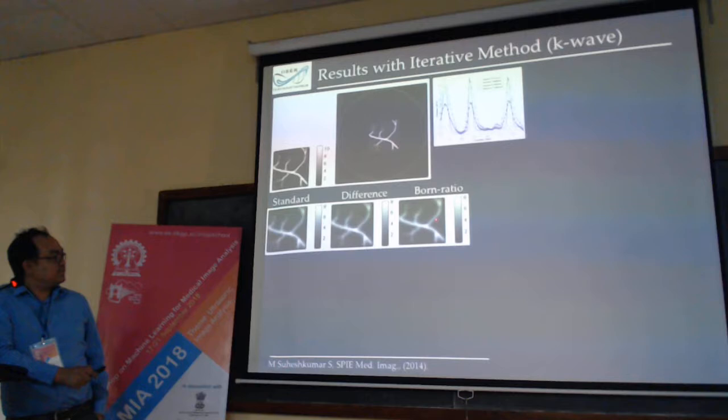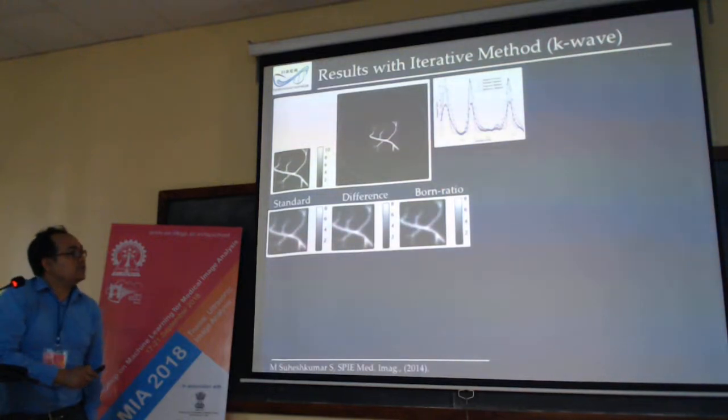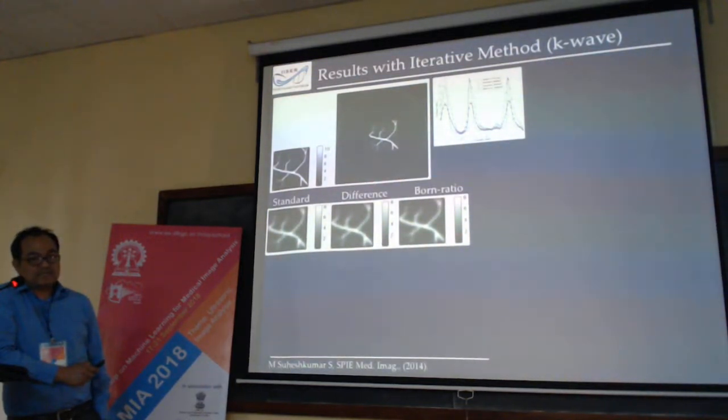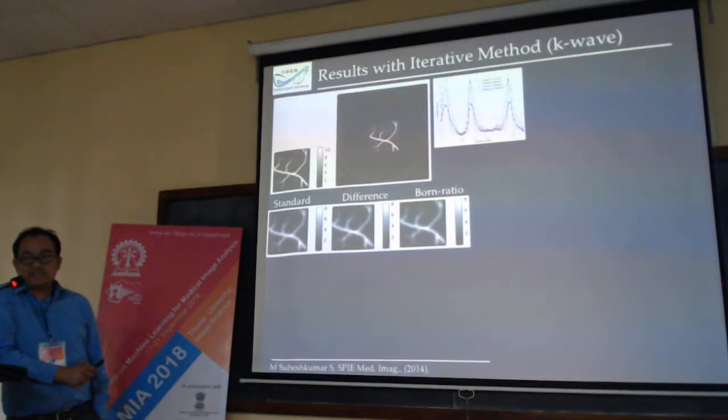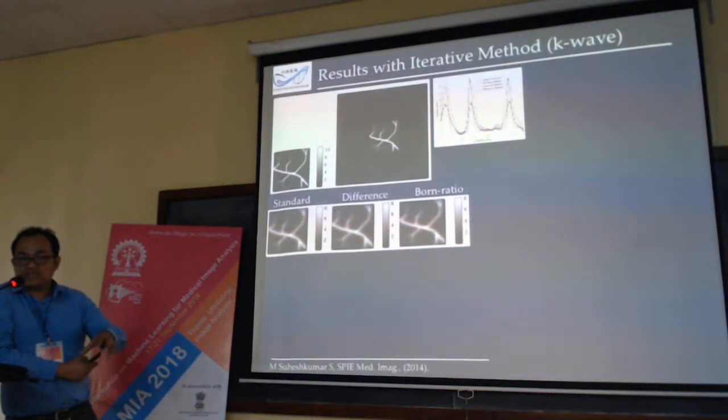It was quite successful. What we propose is that in the conventional way of reconstruction for photoacoustic tomography, people neglect the acoustic signal coming from the background. For ultrasound imaging, we need to immerse the sample inside a background, such as gel or water.